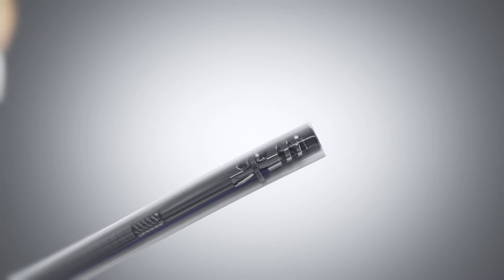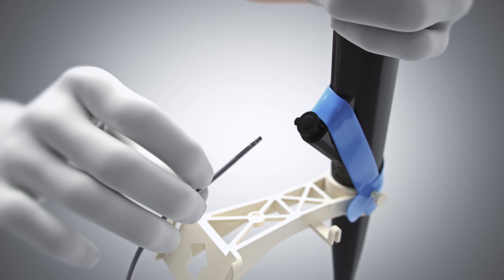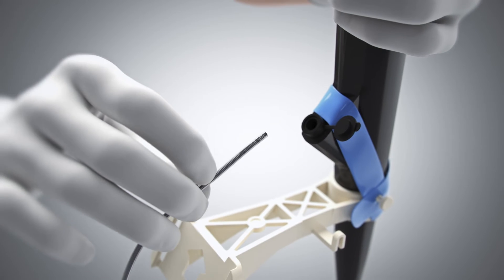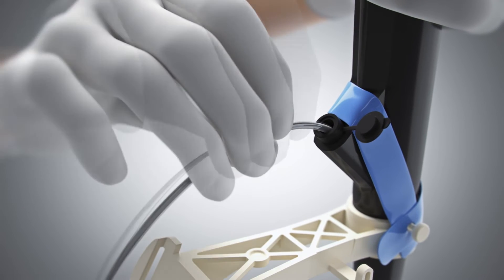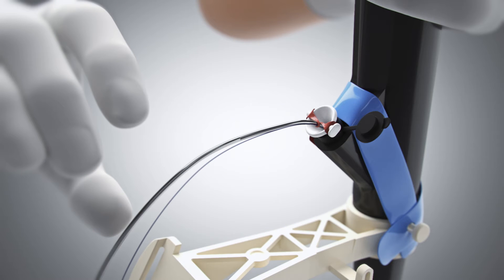Insert the X-TAC device with preloaded helix tack and scope liner into the scope channel. Ensure the biopsy cap is open and the scope is straight. Fully seat the scope liner funnel into the biopsy cap.